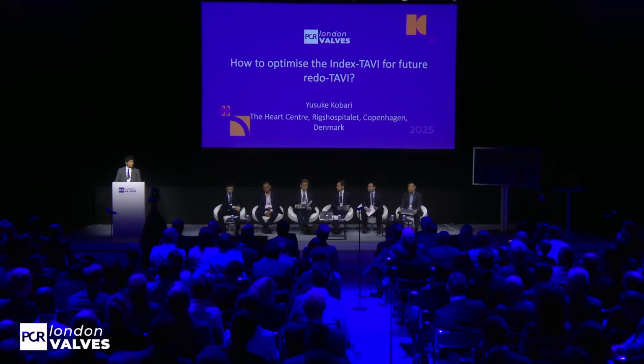So I think for this kind of case, I would prefer to avoid too-high leaflets, because in the future, the second, third valve may have difficulty. So I would definitely choose an intra-annular valve. Yep. So this would be my starting point. And secondly, I would choose an intra-annular valve with very good hemodynamics, because we know hemodynamics could also translate into durability. Yep. So this is my approach. Yep. So lifetime management and durability are also quite important. So Yusuke, please continue your presentation.